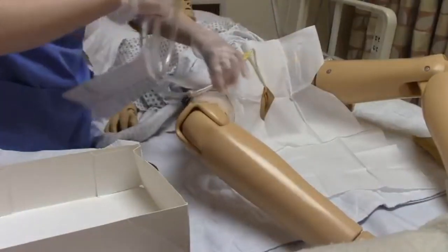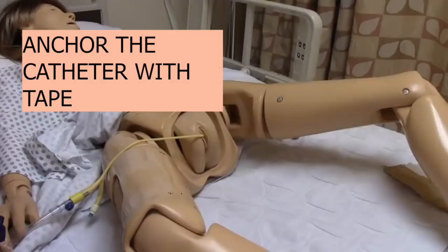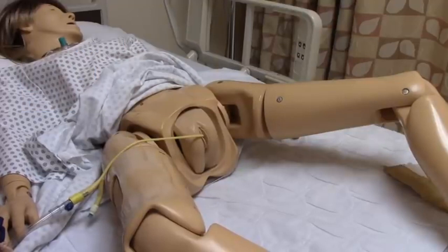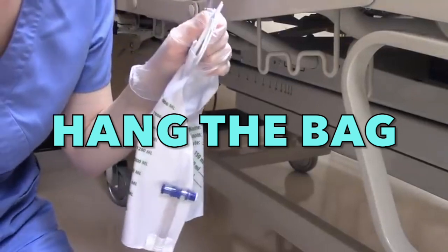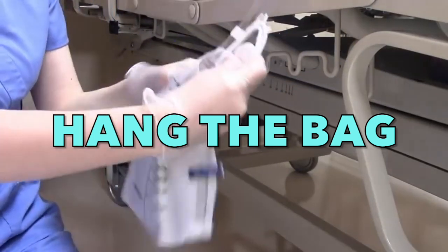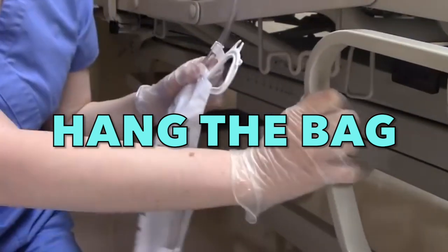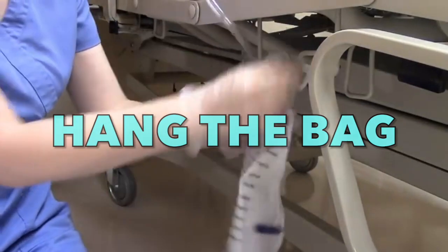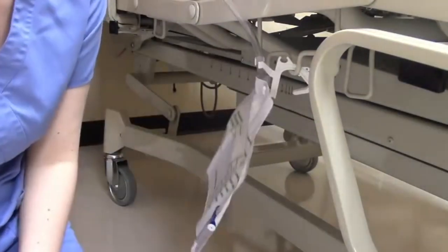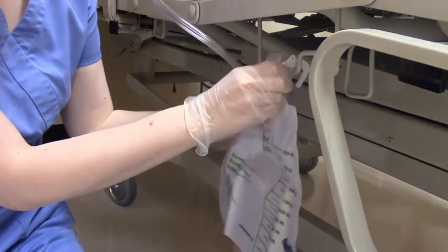We are done inserting the foley catheter, but we need to make sure to anchor it on the patient's legs using tape. Hang the urobag — not on the floor, it should be hanging, connected to the patient's bed. This is to prevent ascending infection.